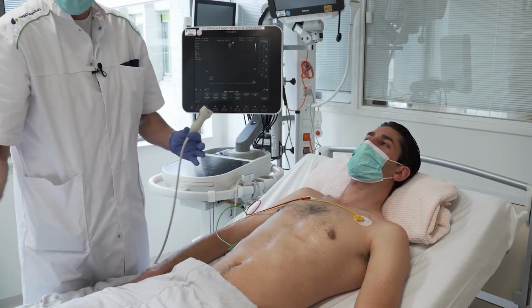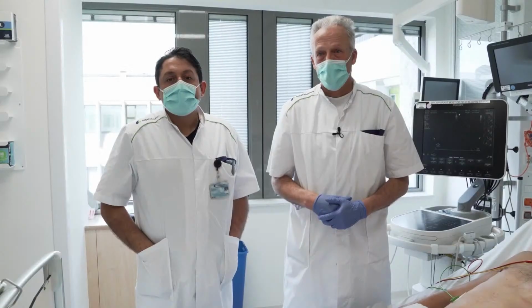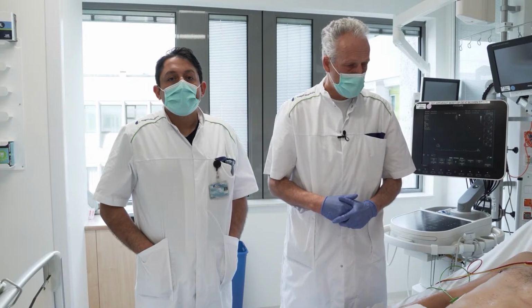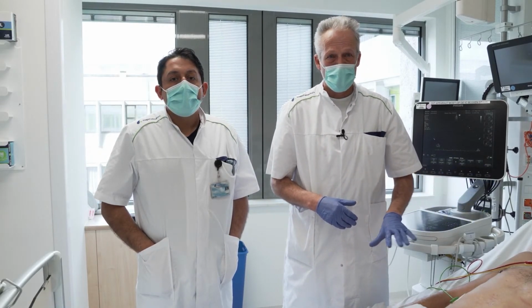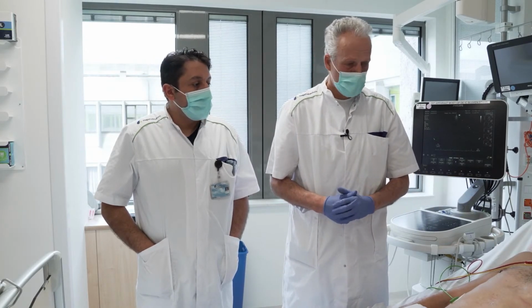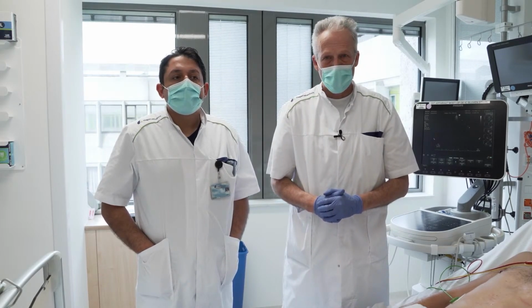And you don't have to go through the scan or make x-rays, etc. So we would like to conclude our echo demonstration with that for acute medicine. We showed you the 9 or 10 windows. You saw that it's very fast, it can be very reliable, it's not invasive, you don't have to go through the scan, you don't have to make x-rays.